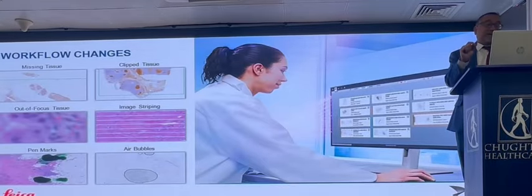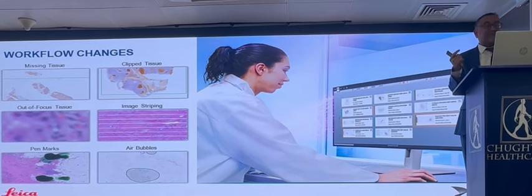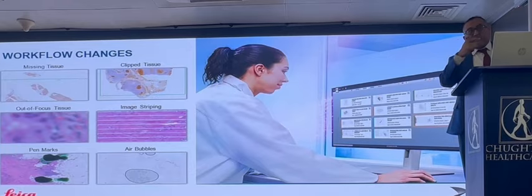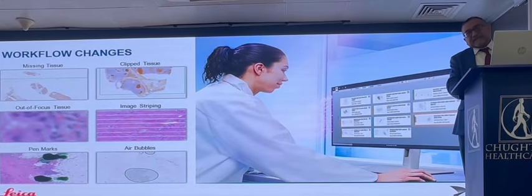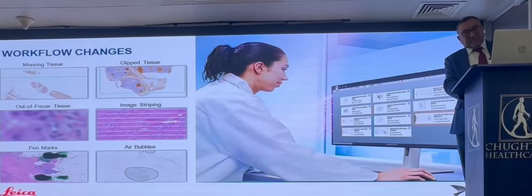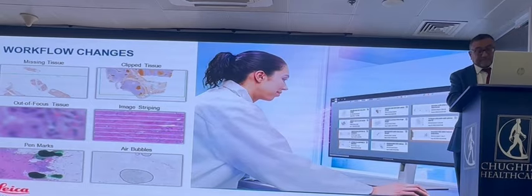But there are also workflow changes, like I mentioned, where you have missing tissue, pre-analytical factors, out-of-focus tissue. You have to convert that process into a smooth process for your lab. So it's not simply just taking a blank check and buying a scanner. I'm going to be honest with you, it takes time and effort and dedication to do it.